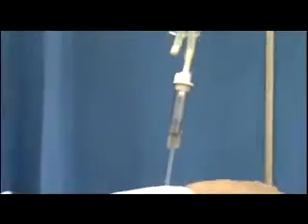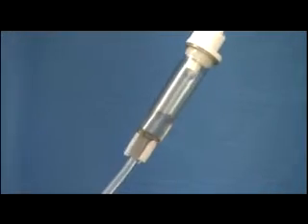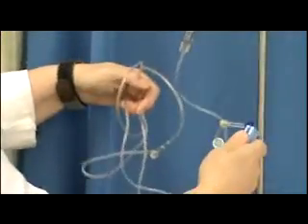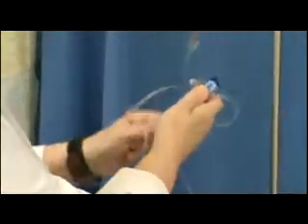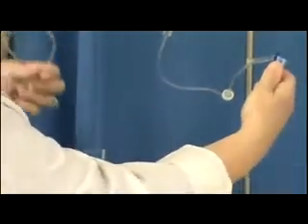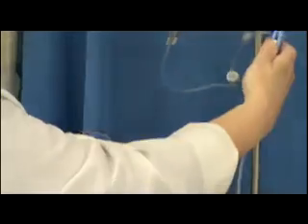See, here comes the fluid. And then it's going to go past that port. And then you watch your fluid level. I don't know if we can follow this. We want our ports to be inverted as the fluid comes by. Here comes our fluid level here. Got to keep this down or it won't run.